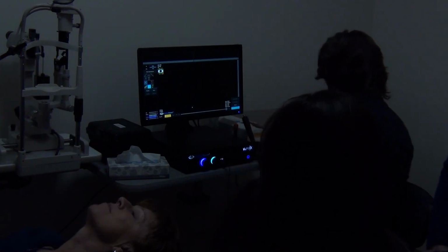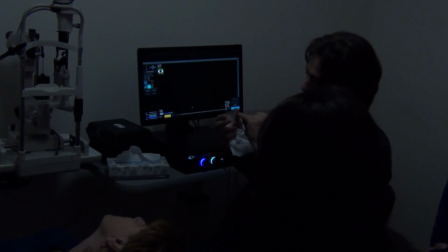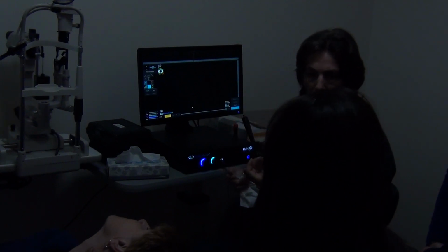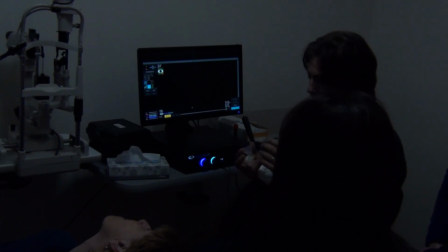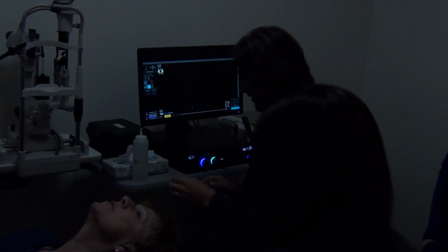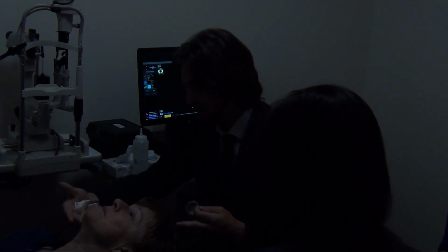When you pour water, I'm going to do a 20 millimeter shell. When you pour water in the shell, use the side, the walls of it. Don't go directly, and don't do it too fast, because you may create air bubbles inside of the water, like sparkling water, and then it will affect your image as well. So the chin slightly down.